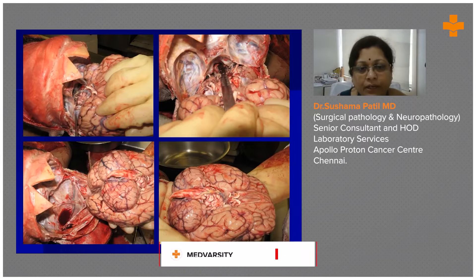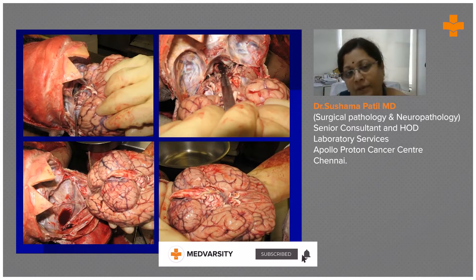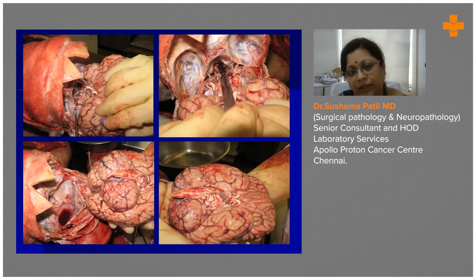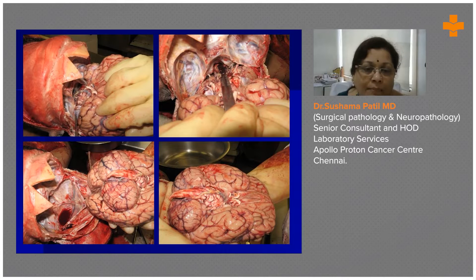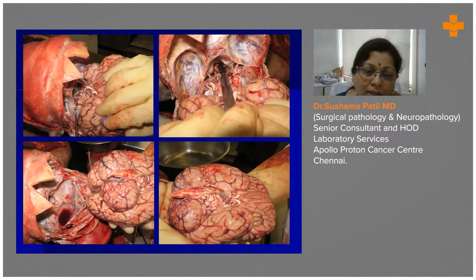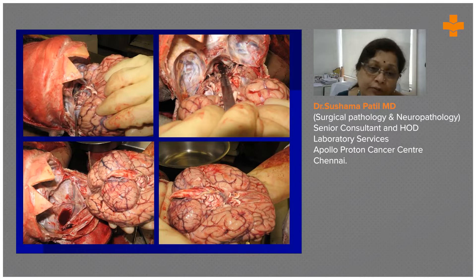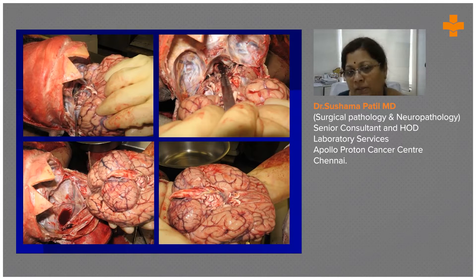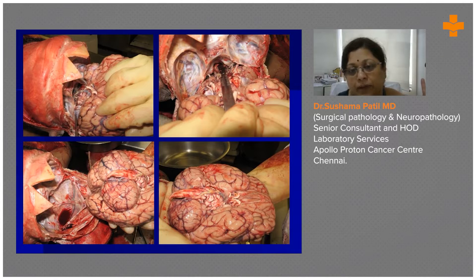We gently remove everything, then the tentorium comes into picture and we have to gently cut it out. To deliver the brain, here you can see the basilar artery, and if I'm not wrong, you can see some yellow plaques here — this is atherosclerosis. Most patients with diabetes have atherosclerosis that is visible right away when you take the brain out, so without even a history, we can tell the patient may have had diabetes.